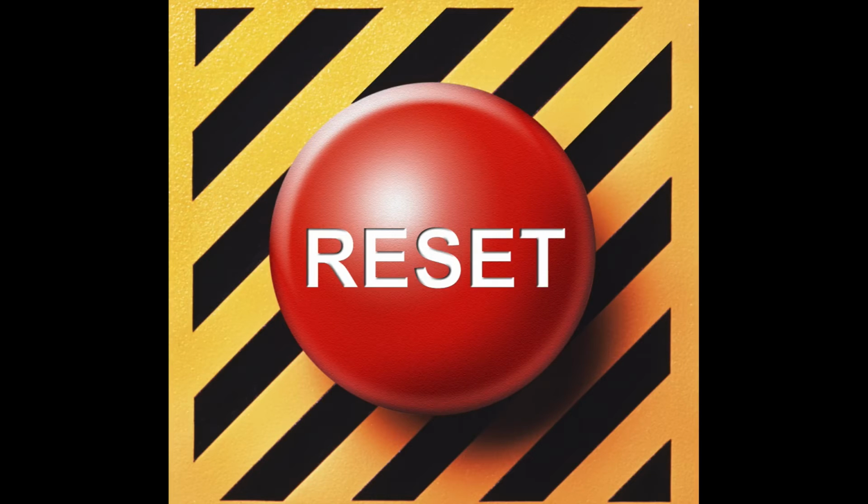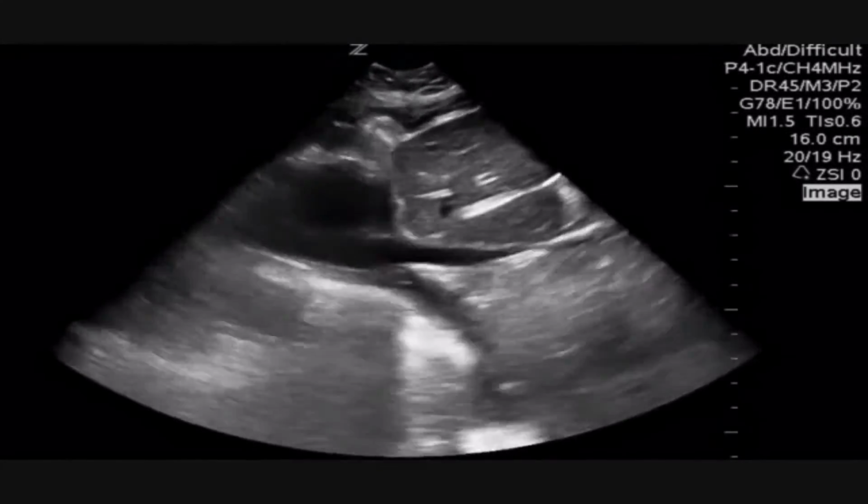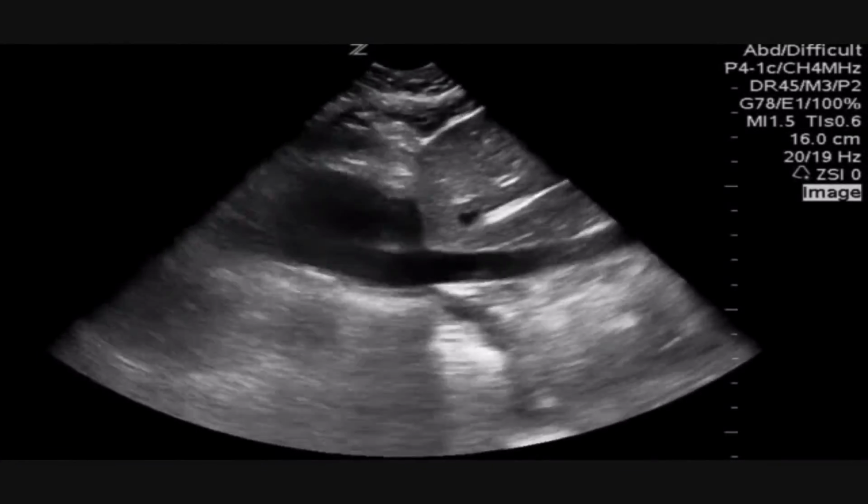Well, shoot, I was thinking about BiPAP, I was thinking about afterload reduction, and now I am not sure. Also, maybe this is non-cardiogenic pulmonary edema. This actually needs to be dispositioned to medicine. Perhaps she has mostly diastolic dysfunction, so I'm going to go to the IVC and just document that she's volume overloaded. And this is what we see.